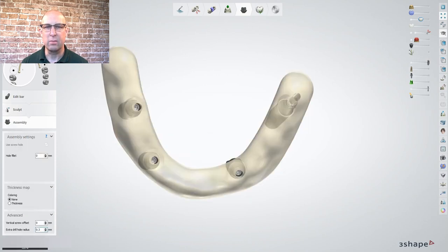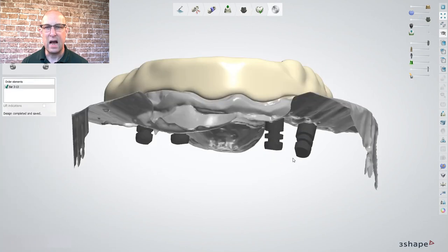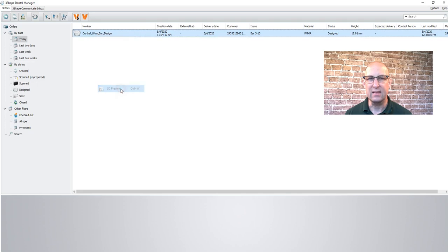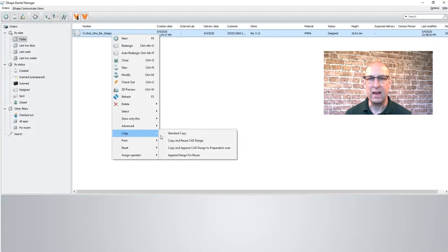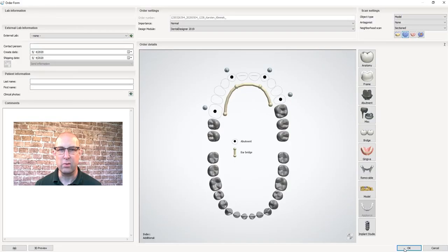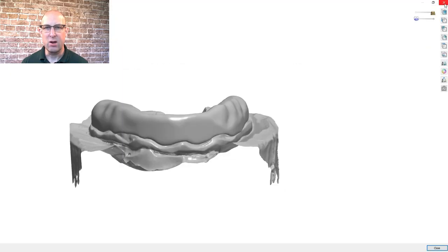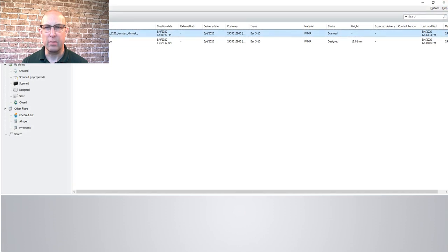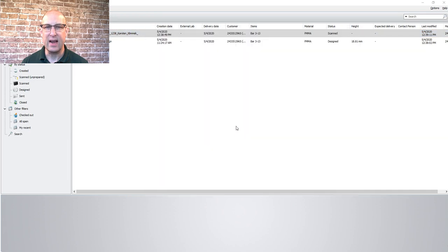Avoid any adjustment of the bar in this step since this will cause errors in the appending step. After the bar design is finished, the model and bar design are two separate pieces, so right click on the bar order form and click on copy and append design to preparation scan so the bar and model are merged. Notice that the holes were not copied. Right click on the new order and under advanced select export scan and name the file bar design.